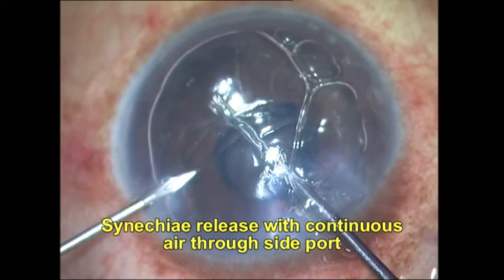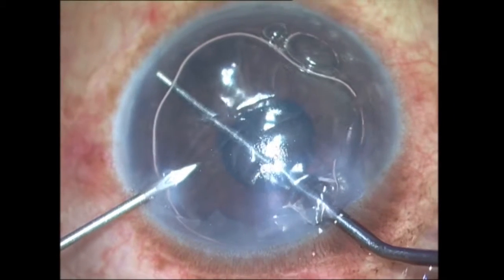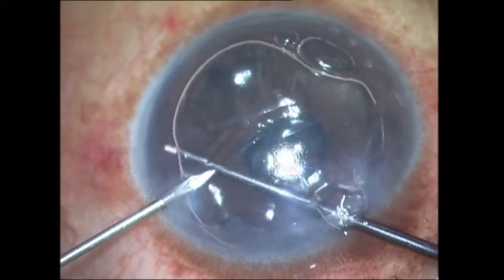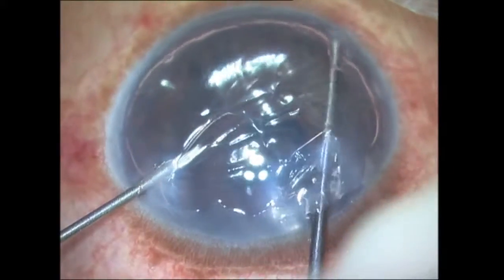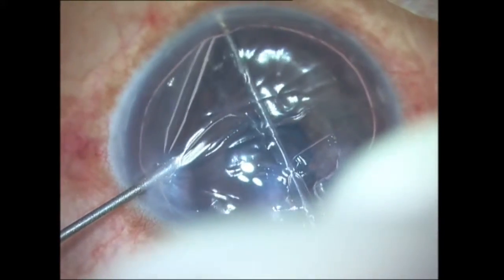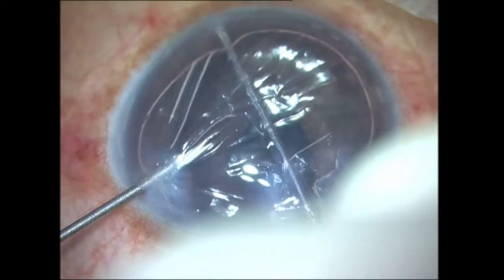Now I'm going to first release the peripheral anterior synechiae because I don't want them there after having put the graft in. They can cause possible graft detachment, and they don't give you enough space. You can see I've got continuous air going into the anterior chamber through a needle, and that's the reason I call it air pump assisted PDEC.